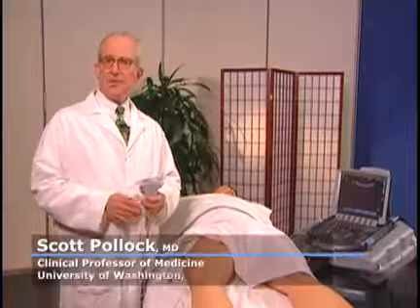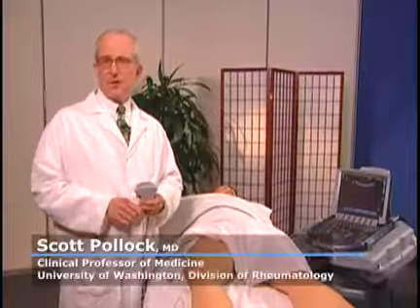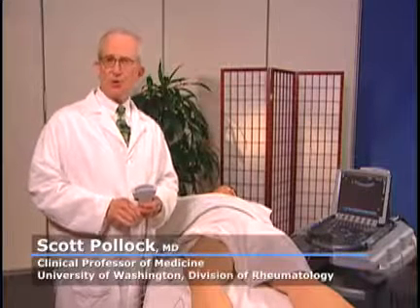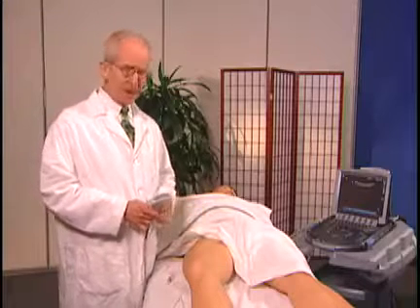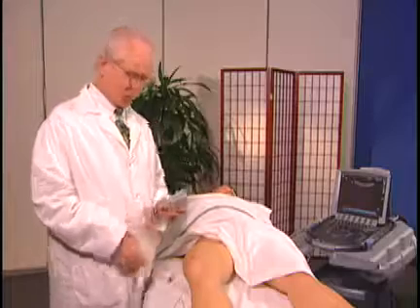I'm going to do a simulated hip injection now and show you how this is approached. I'm not using a sterile technique, and I'm not actually going to insert the needle, but I will show you how it's approached.